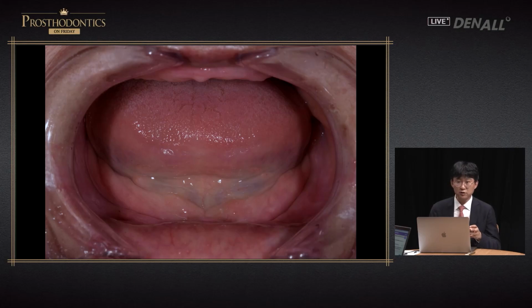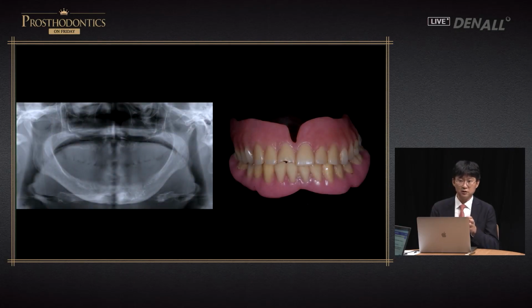This is a similar patient to previous cases. And if you observe X-ray and face, the existing denture shows a considerable displacement to the left of the mandible. Usually the upper left posterior should be in the outward border like this, but it is way outside the border. The left TMJ is noticeably smaller than the right. Against the entire face, the mandible is very much displaced to the left. With this condition, this patient can chew to a certain degree, but with a little bit relaxation and guidance.